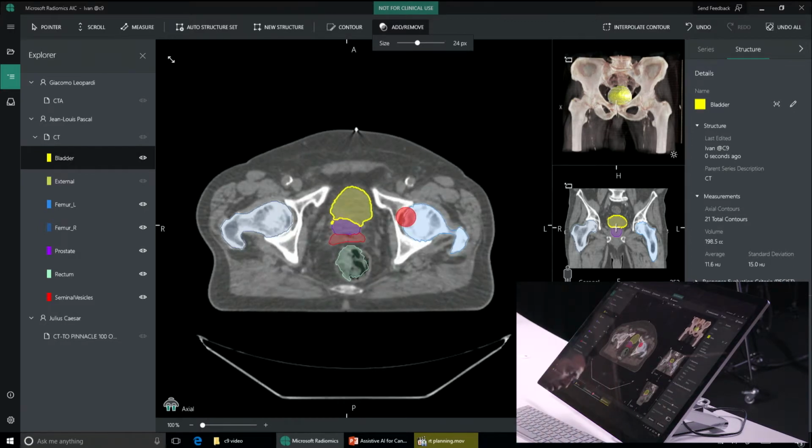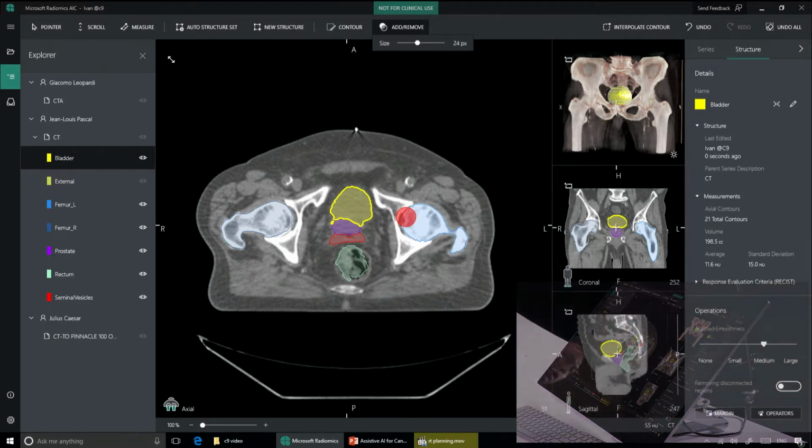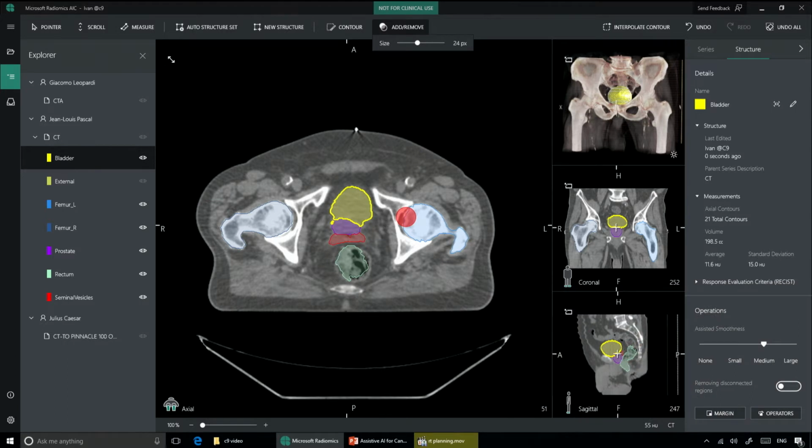But still, rather than doing it from scratch, you're just fixing up the work. So the majority of work, 90%, is done by the AI. So you've taken something that may have taken 40 minutes to an hour down to maybe 5 or 6 minutes to make sure that it's okay. Yeah, this is the hope, right? And again, you're fixing someone else's work as opposed to creating the same thing over and over again.